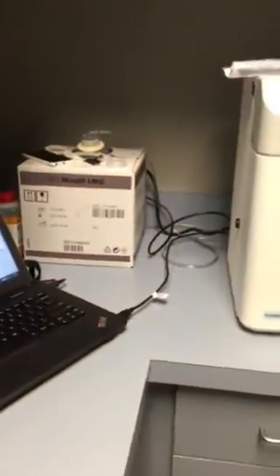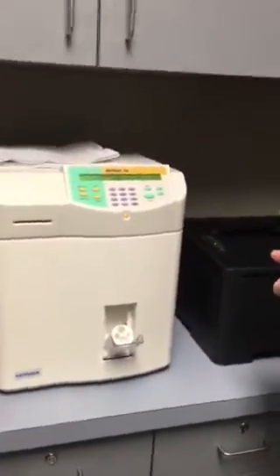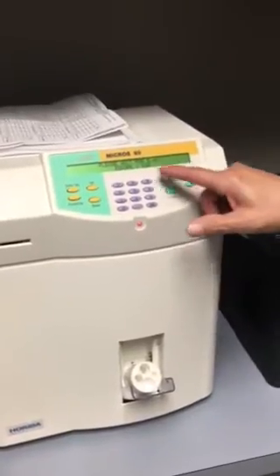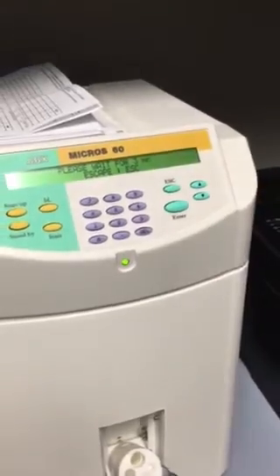The first thing you want to do once we have that open: turn the power on here and let it warm up. I already had it warmed up, so I'm just going to hit escape. Normally it has to warm up for three minutes.